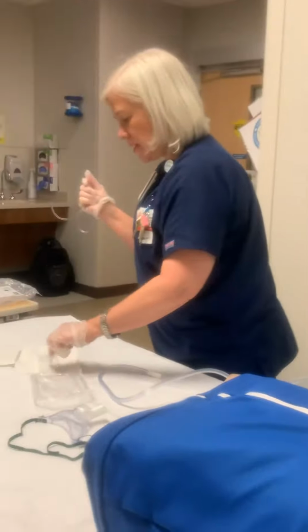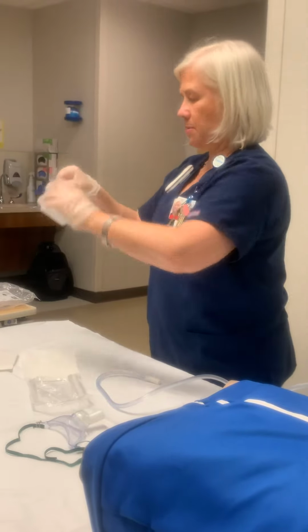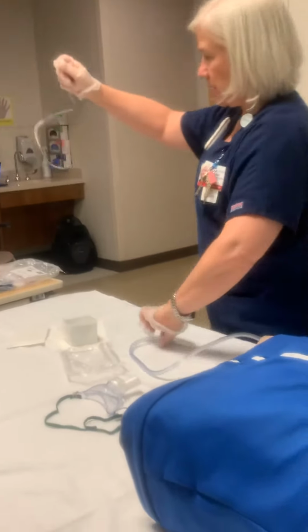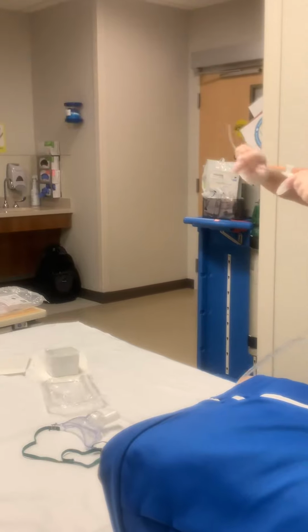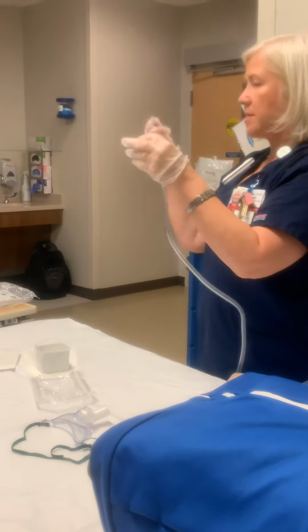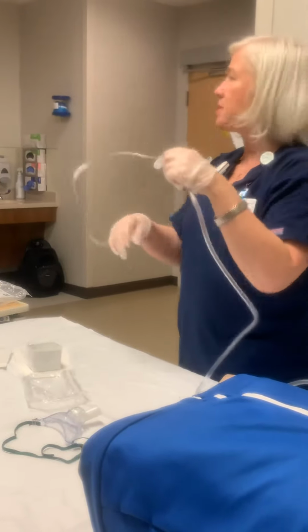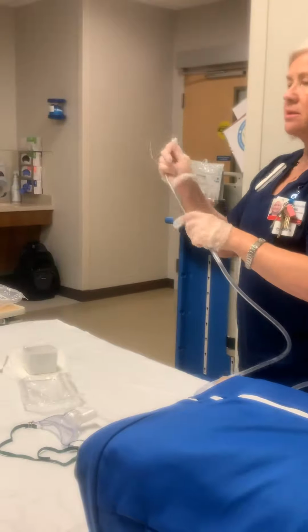You also have in here this little cup, put sterile saline in there so you can clean out your tubing here. Okay, I don't have saline, but anyway, I'm gonna leave it right here. I usually like to wrap it around here just a few seconds because, for purposes of this, I'll break sterility on this here. Because what I've had happen before, if I don't do that, I'm touching my arm or something like that. So I'll just do it like this just to hold it a little bit more stable.